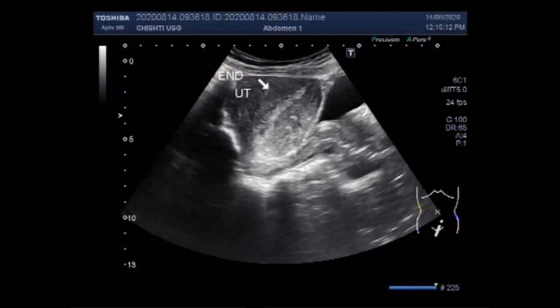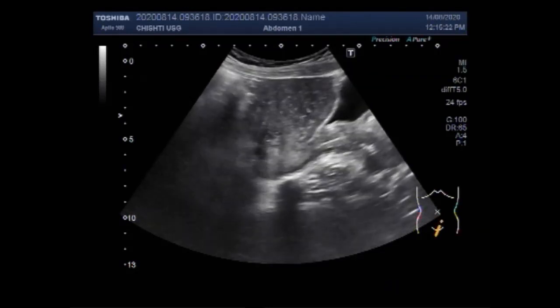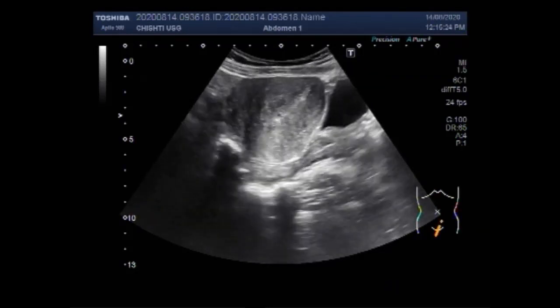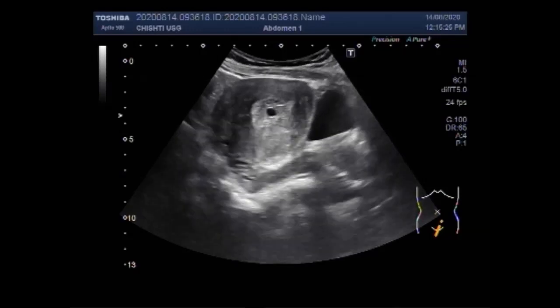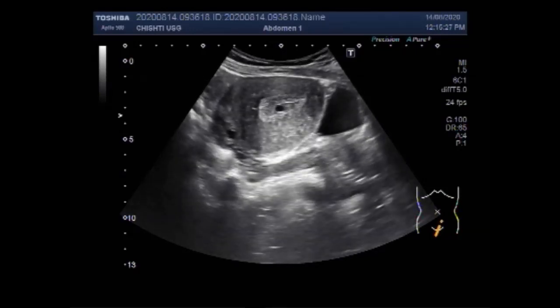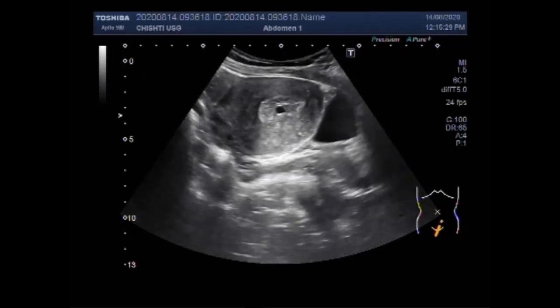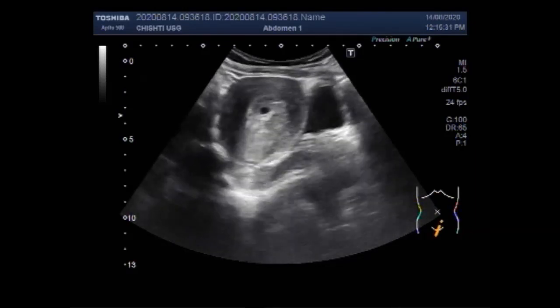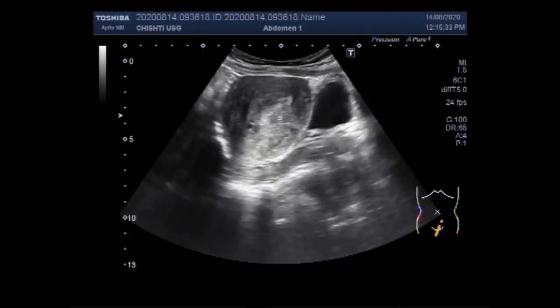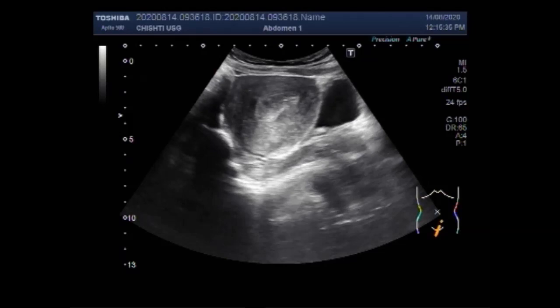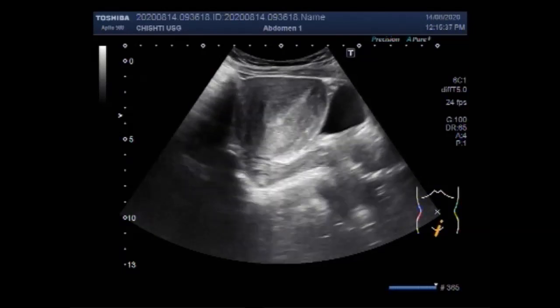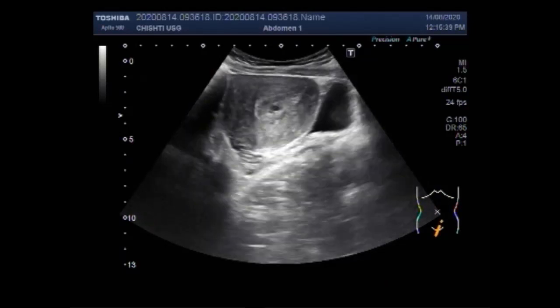Now you can see the endometrium and the endometrial thickness is going to be measured — it is increased. Endometrial hyperplasia is a condition in which the endometrial lining of the uterus becomes abnormally thick. Although endometrial hyperplasia is not cancer, it can lead to uterine cancer in some women.